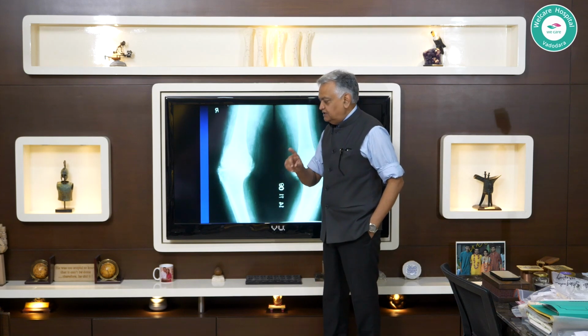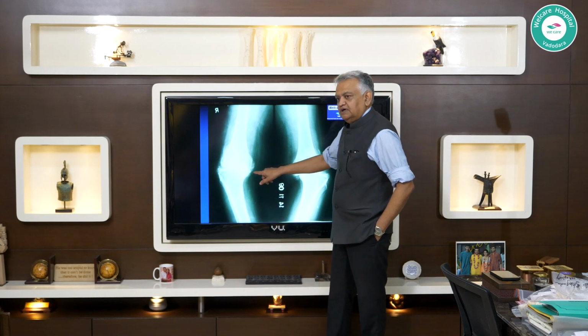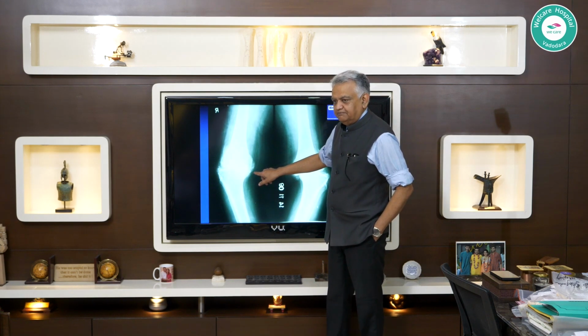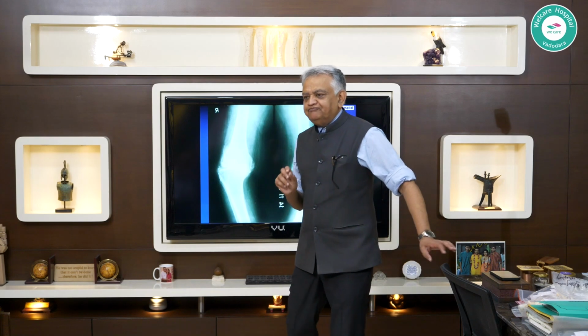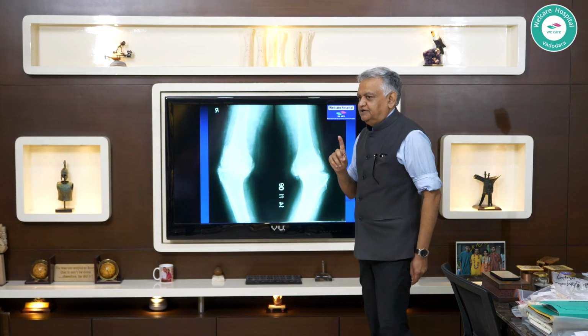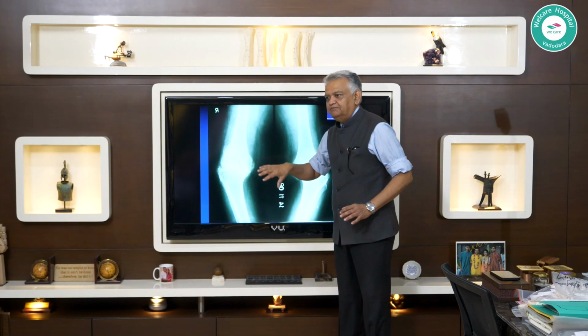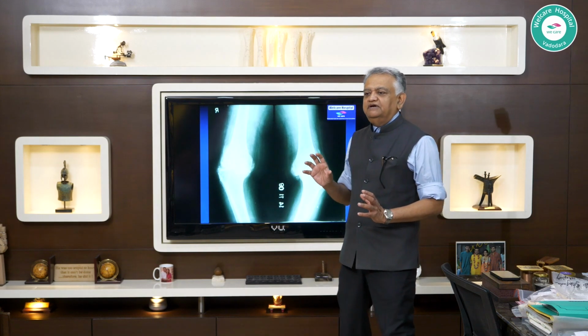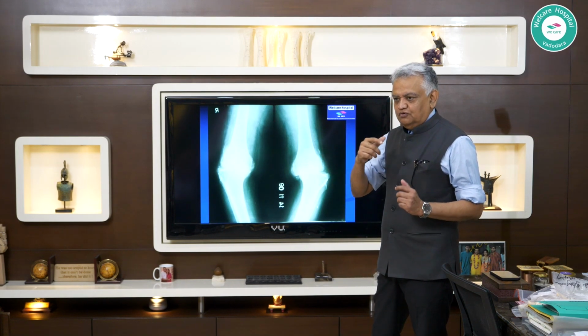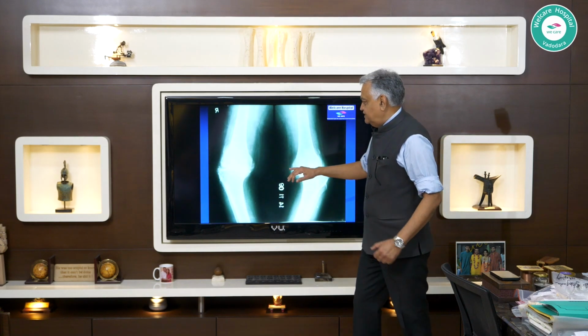You should not be worried, and when you do that, sometimes it looks frightening that a lot of lateral side tibial plateau is being cut. Don't be frightened. It looks more because the medial side is deficient. That is why it looks dramatically high. Many times I told you earlier on the table that it is the osteophytic build-up on the anterior lip of the tibia which will give you the appearance of taking away too much. So I take that out, the anterior tibial lip osteophyte.